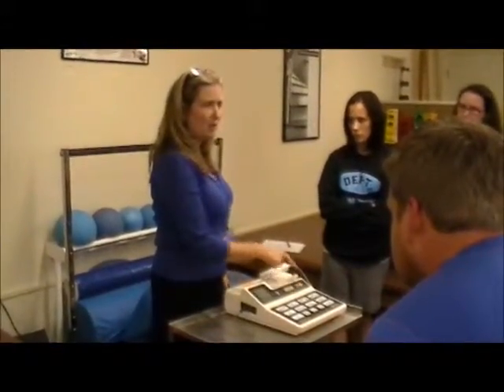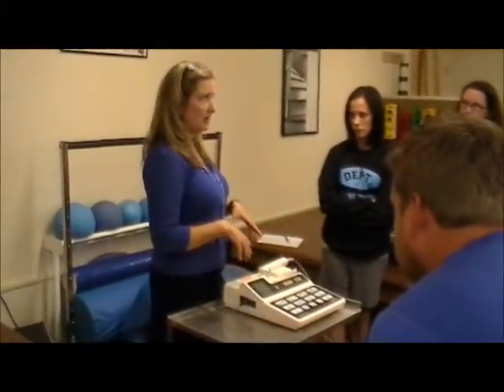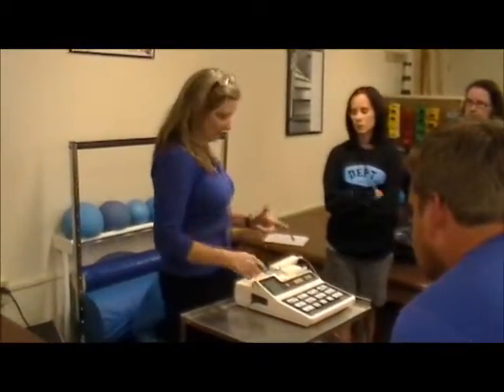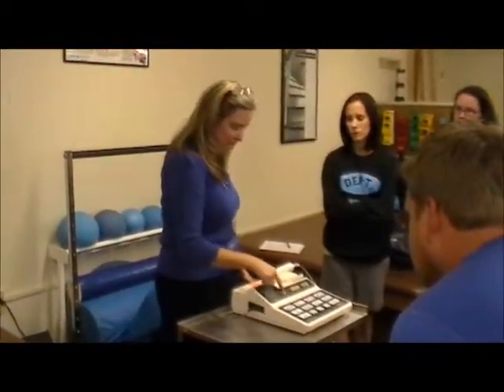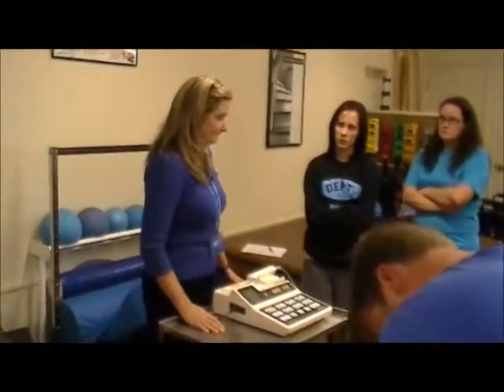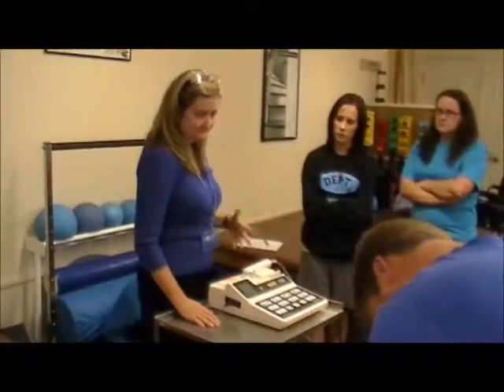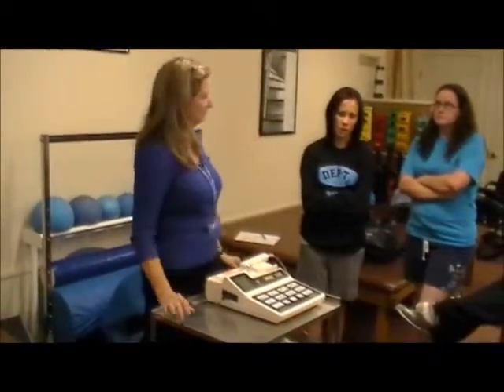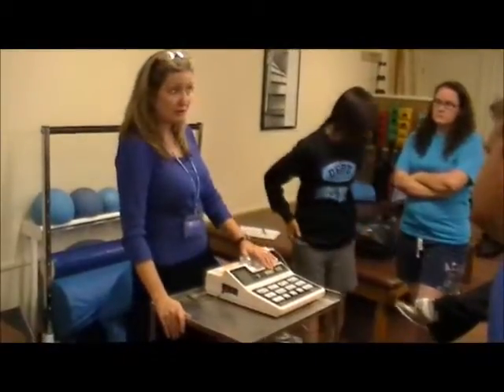So you might not want channel 1 as strong as you ultimately want it. Get it, you know, close, do channel 2, get it close, and then fine-tune. Just whatever the box is around and whatever number is showing here is what you're adjusting on here. Okay? Give the patient a bell, get them comfortable. Whatever. Now, I don't want y'all to do it for the full treatment today.